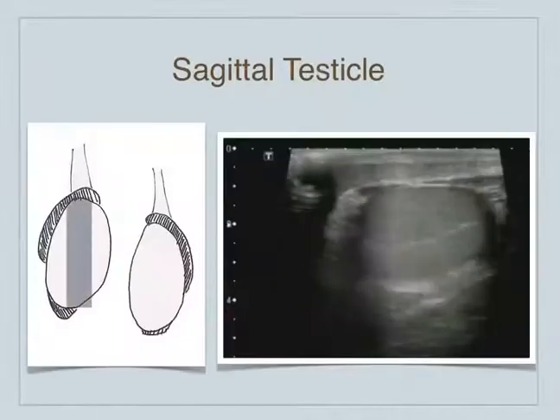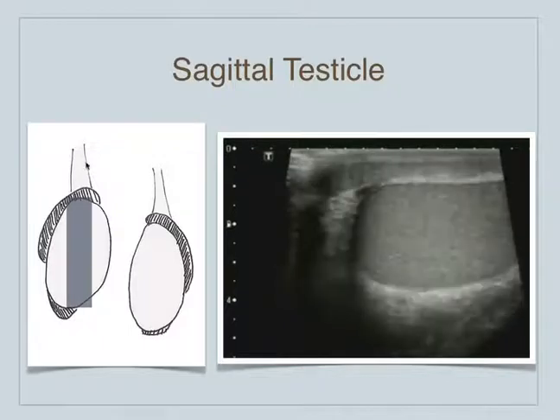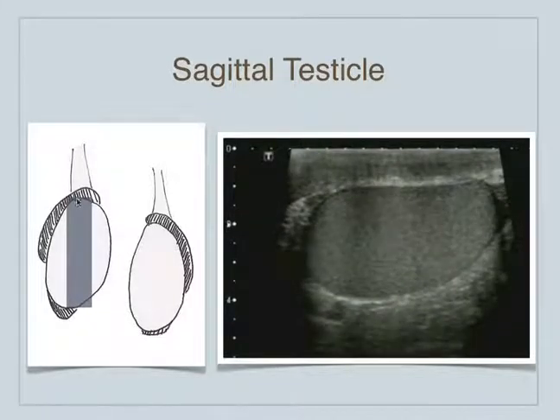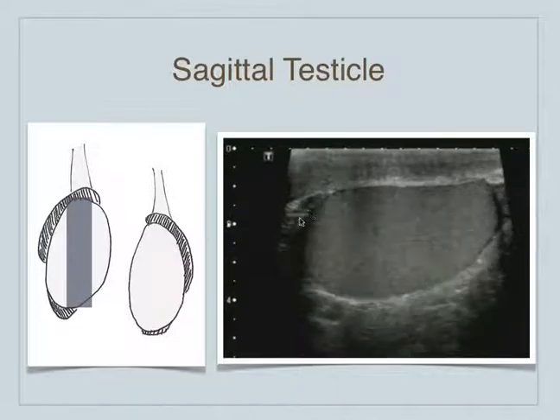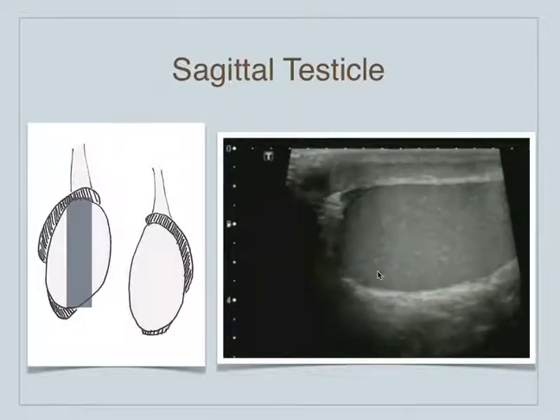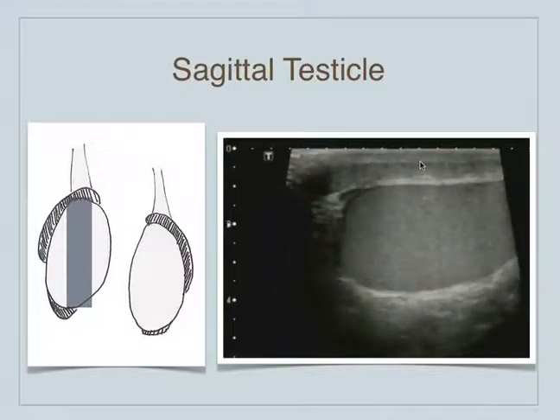I'm going to show you a series of testicles here showing the probe position. This is supposed to be the epididymis — sort of the head, the body, the tail. The spermatic cord is up here and this is the probe position. You start in the sagittal plane, and the probe picks up maybe a small portion of the epididymis, the head of the epididymis here. But this whole structure here is the testicle, and this is the scrotal skin seen up here.